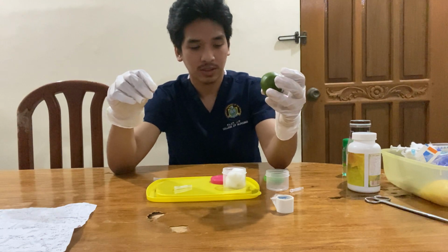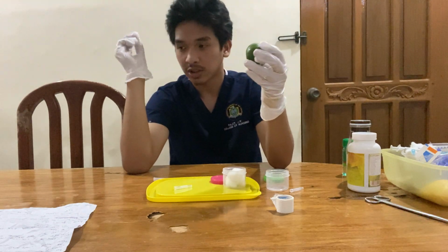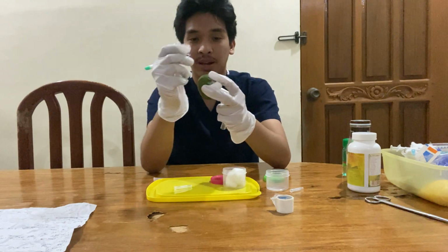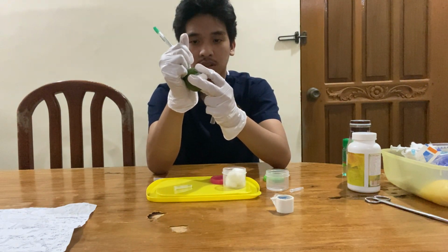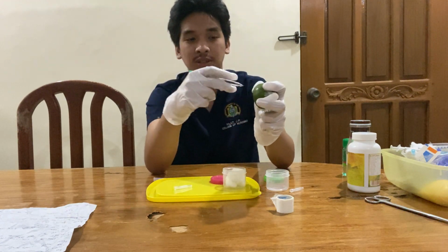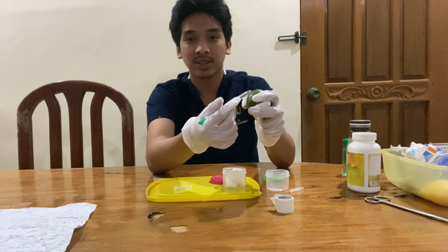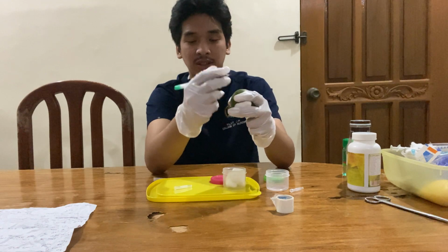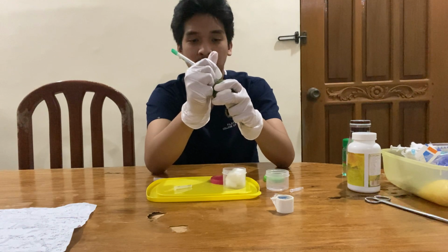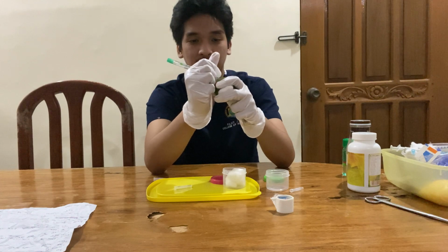Okay, so once it is done, we will draw a circle around the bleb. Okay, the point of the circle is that we will check if the bleb goes out of this circle. It means there's an allergic reaction, and if none, he's okay. And we'll write the time. Since now is 7:30, we'll write the time 8 o'clock.